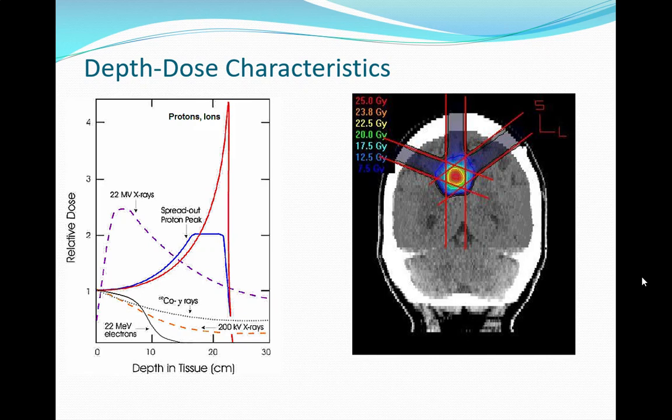Anyway, we want to take advantage of this, right? Because tumors usually happen inside. Here we go. You can see the effect over here. I'm trying to hit a tumor. We come in from a couple directions. Look how low the dose is on the entry beams versus where we're targeting some tumor inside. You can just see by the intensities of them, I'm able to put things where I want them to and essentially avoid creating excessive amounts of damage to somebody. That's a huge advantage if you think this is your brain.